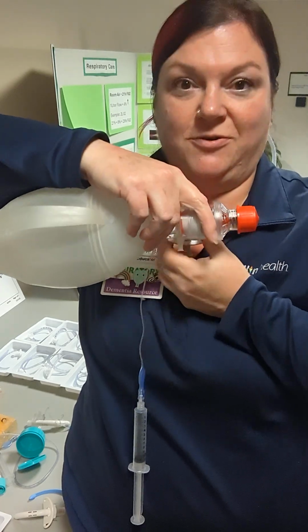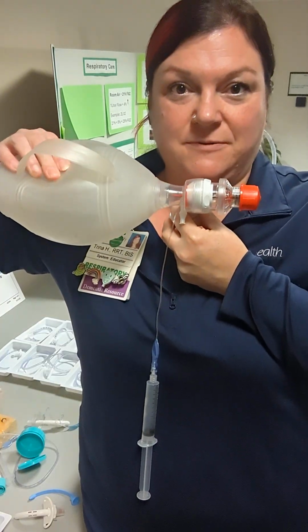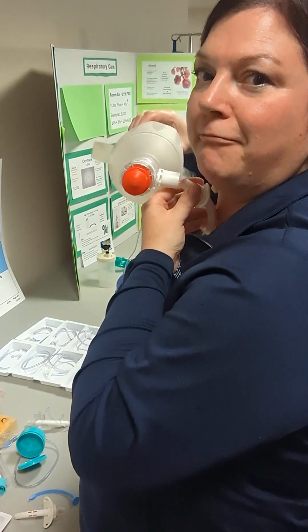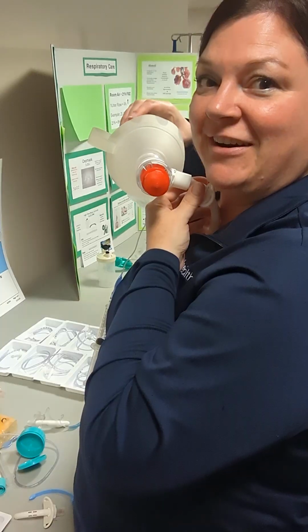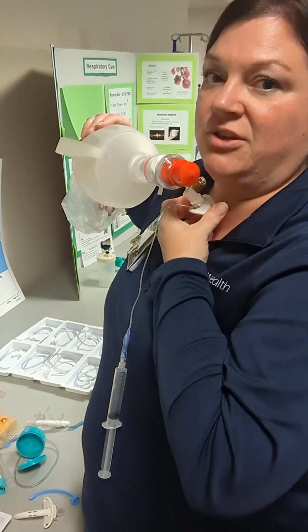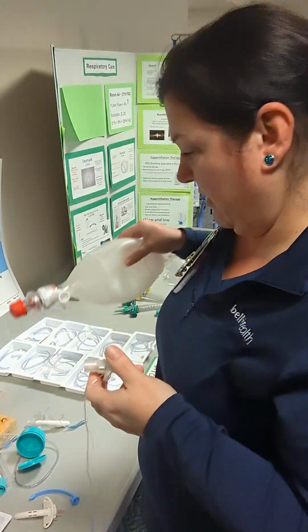And you're going to bag like this, because that air is moving in and out, pretend, here, right? We're not using this upper airway. So if an emergency, you are going to ventilate your trachs at the tracheal airway site.